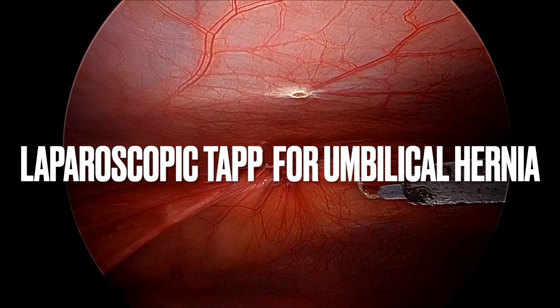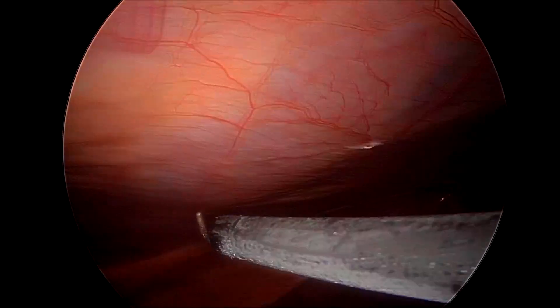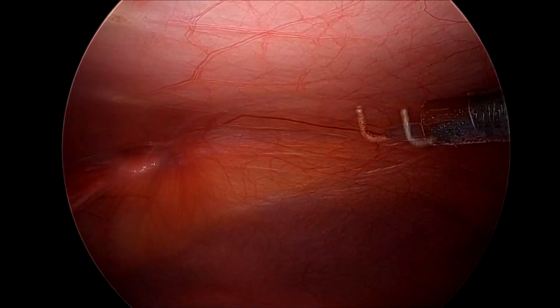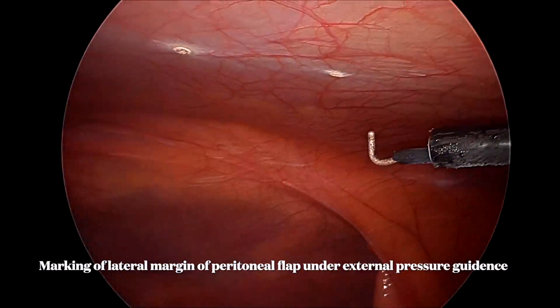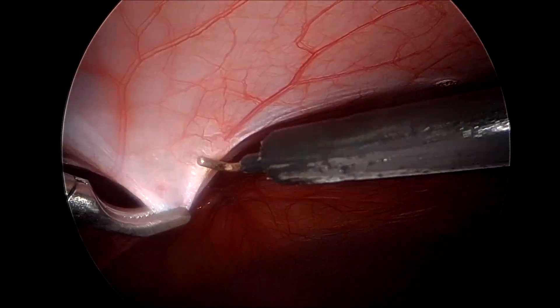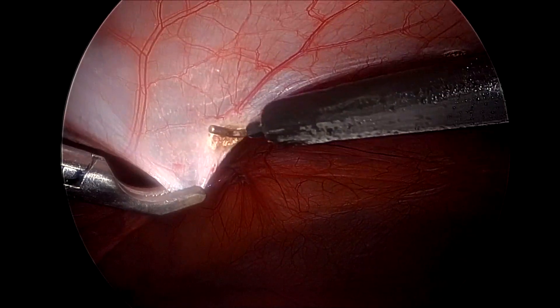Hello friends, this is a video of laparoscopic TAPP mesh repair for primary umbilical hernia. We start by creating pneumoperitoneum from Palmer's point, and after achieving pneumoperitoneum we make a marking approximately 7.5 centimeters all around the hernia defect.